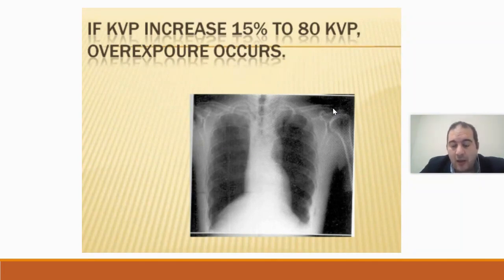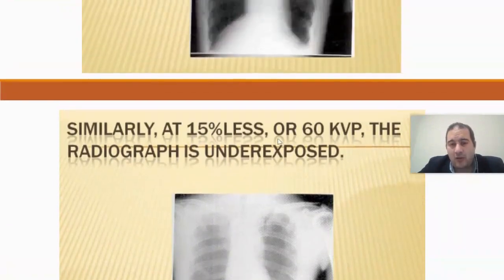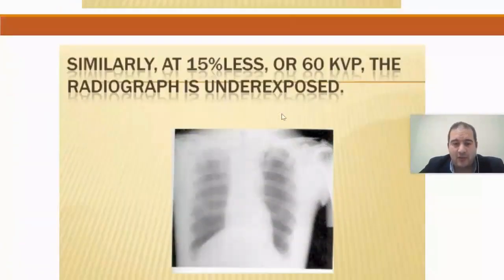The image has changed. So what happened? When we increased our input, it feels like the image has become different in some places or in a certain area. When you adjusted the kV or increased the parameter, you increased the exposure, as we will see, for example, in the image that illustrates this.